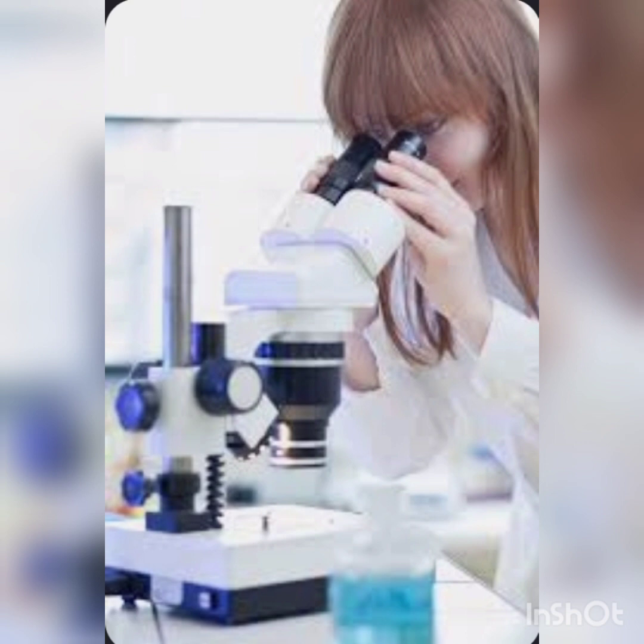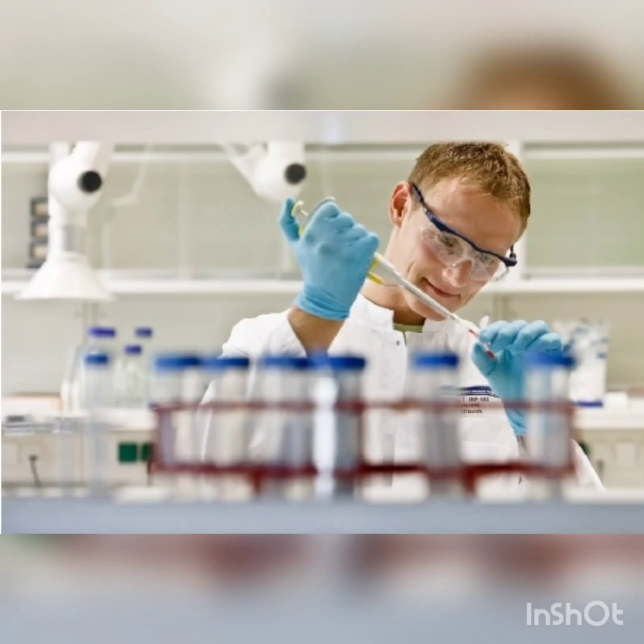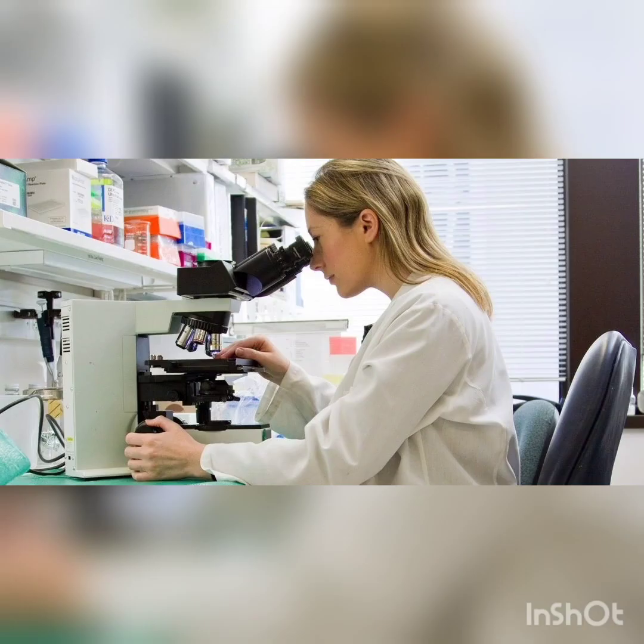That's why gastric washings or resected lung tissues for culture of Mycobacterium tuberculosis need to be processed immediately without any delay.